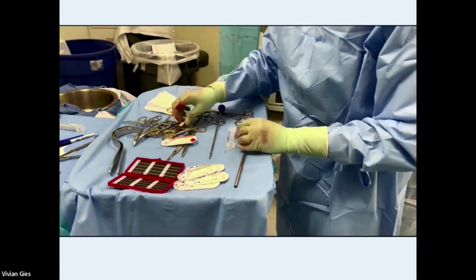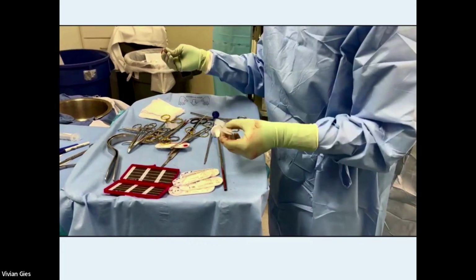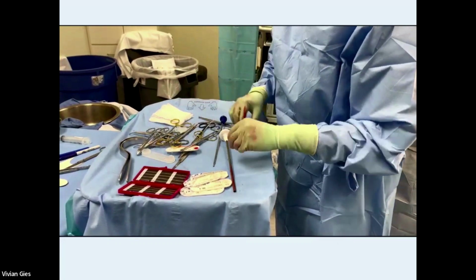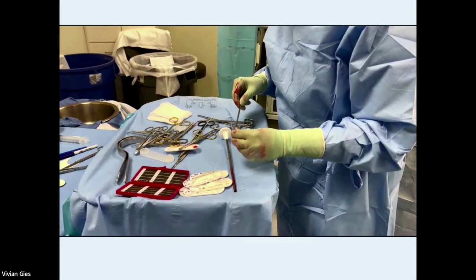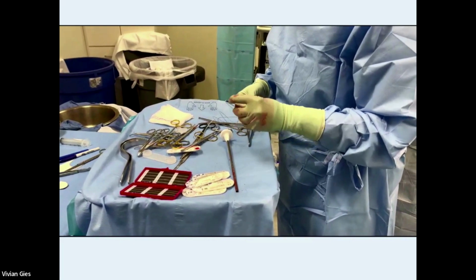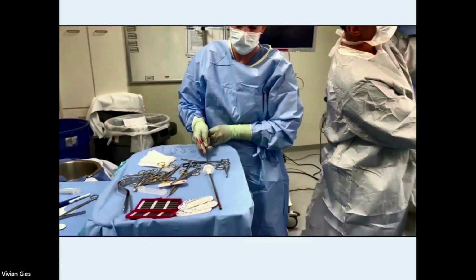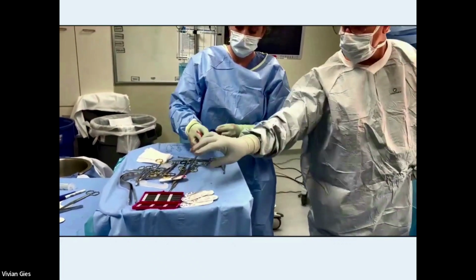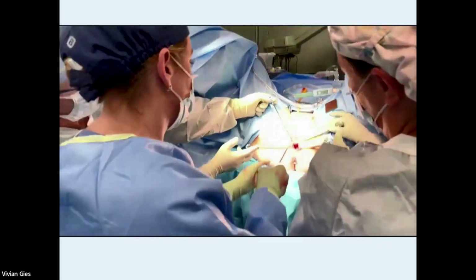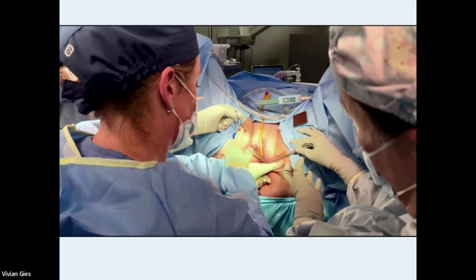And then I'm loading my second tip, which I always do myself. I trust no one. And I always check my tips in my device. Make sure there's no manufacturing issues, place it on myself. And I like to use my Adson to place them on the tip sometimes or take it out, just makes it easier. And I put both sutures on either side. I don't put them on one side. I just like it that way. I'm a purist. I load it, pop it down to make sure it's covered. So that covers it so it doesn't drag any tissue as you go in. And there goes the left side.